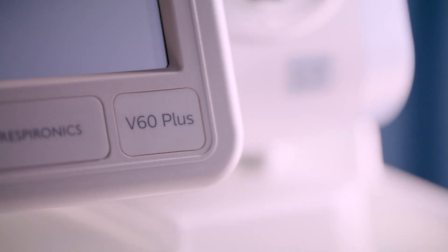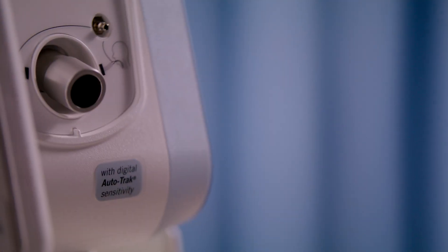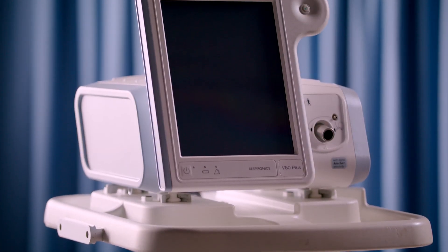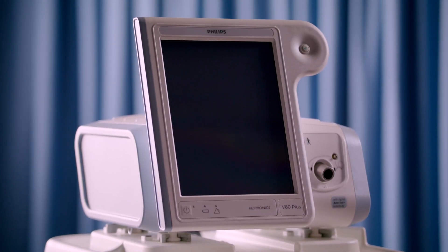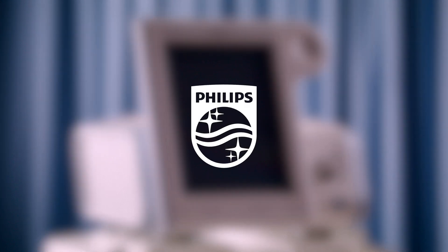Putting it all together, Philips V60 Plus gives you more capabilities within one device to deliver the right therapy to meet both clinical needs and patient comfort. Philips V60.